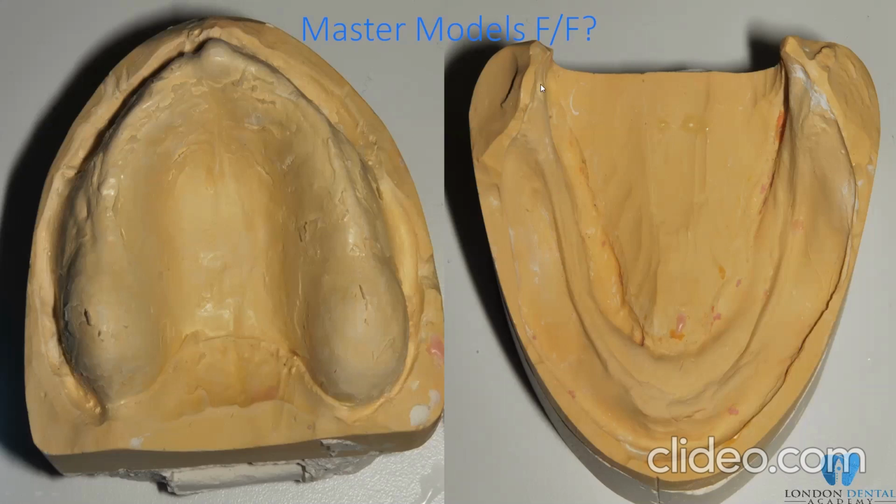And the key area here, the back or the posterior, we call it the retromolar pad, and we need to make sure it's really extended to the two-thirds of the retromolar pad. I'll keep it full in the beginning, but I would say at minimum two-thirds of the retromolar pad. This is very, very important in terms of retention. If you cut it here, the denture will not stay, let alone the fact that it will give you very nice support along with the external oblique line or the buccal shelf.